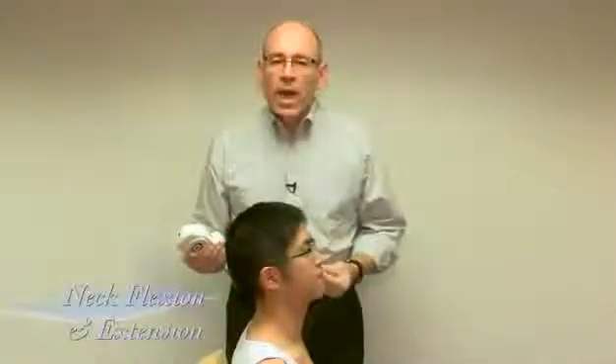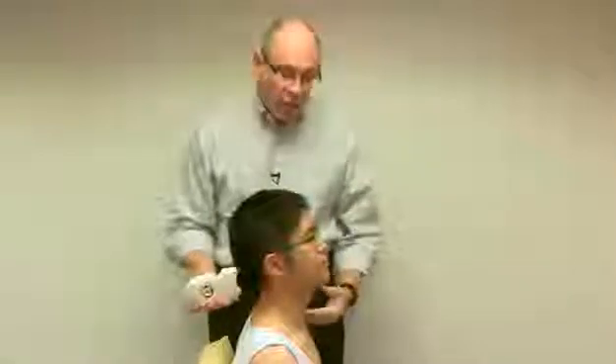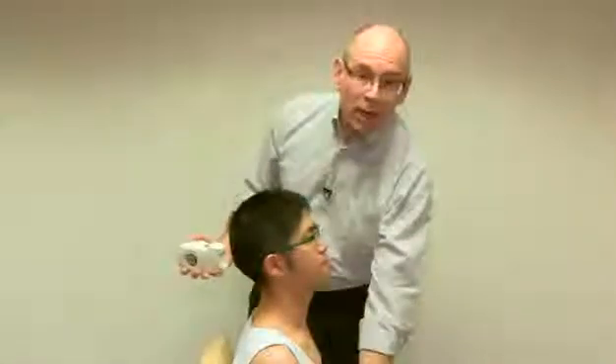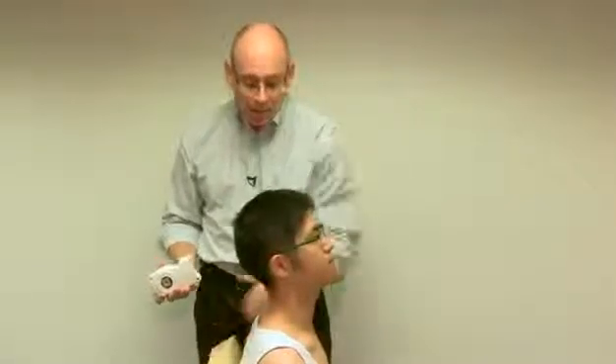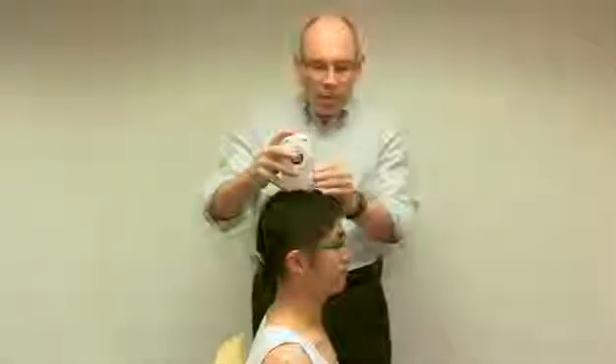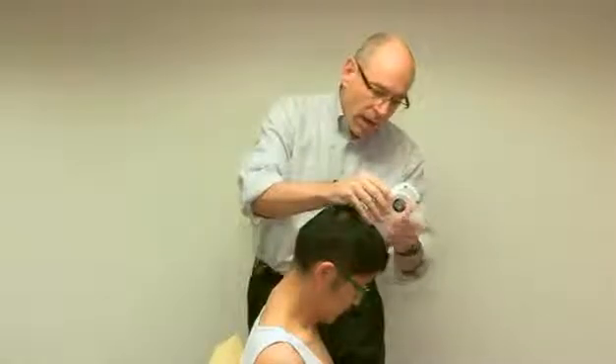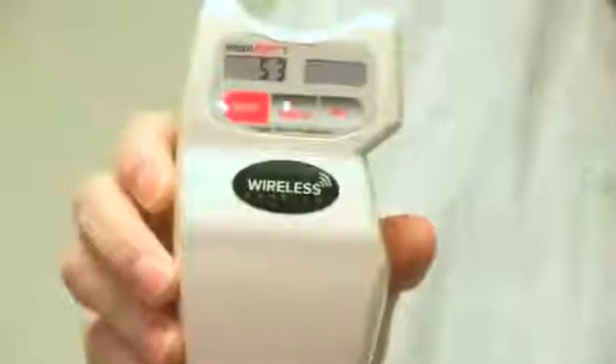Now we're going to measure flexion and extension of the neck in the sagittal plane. In some cases one might put an inclinometer lower to account for any movement in the thorax, but here we're keeping things stable by having him grip the chair. We start where his nose and ear are about in line. I place the inclinometer on top of his head and press the button to set it. Drop your chin to your chest. I click it again, and what we see is 53 degrees of flexion.